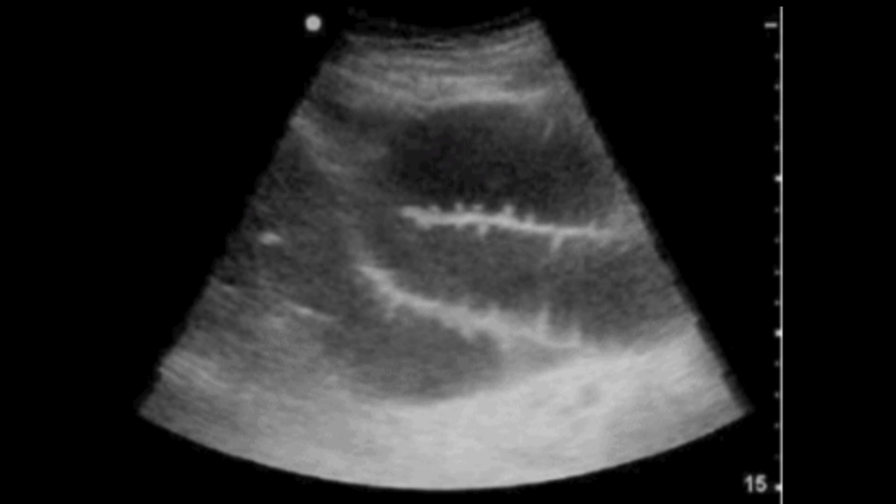Okay. Right. Just a few other things that I think are really useful. Okay, what is that? Okay, so that's bowel, small bowel. And if you see small bowel, now the question is ileus versus bowel obstruction, what's going on? Just put the probe on, because if it's ileus, it's going to be static.